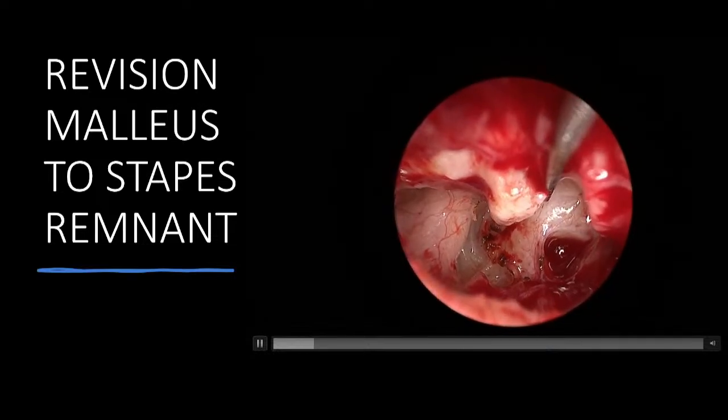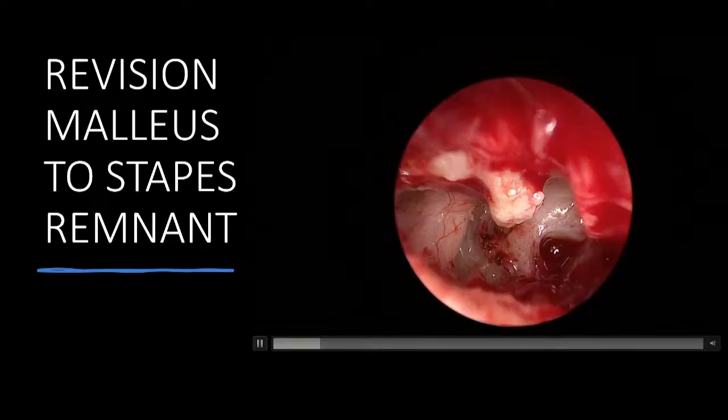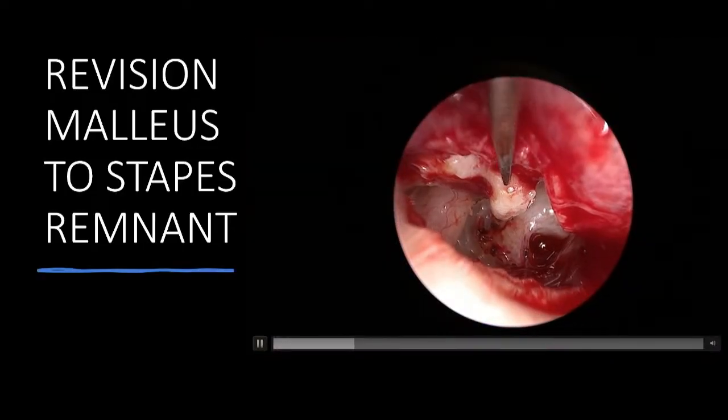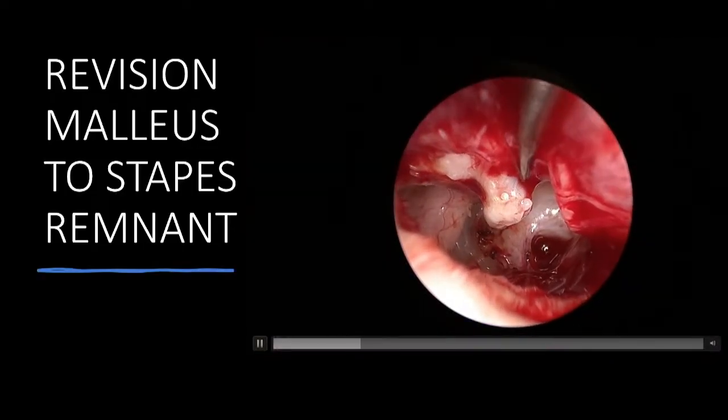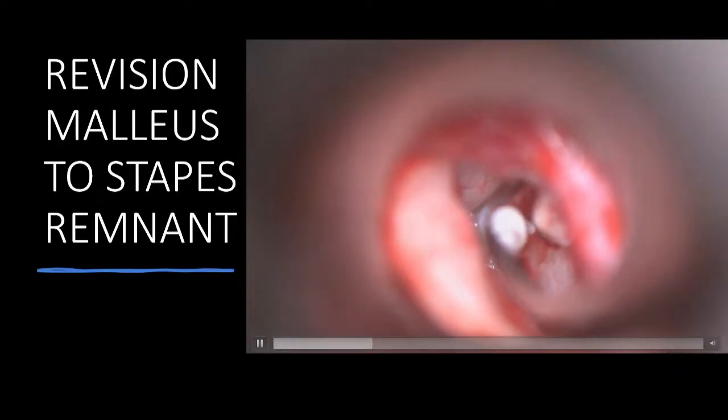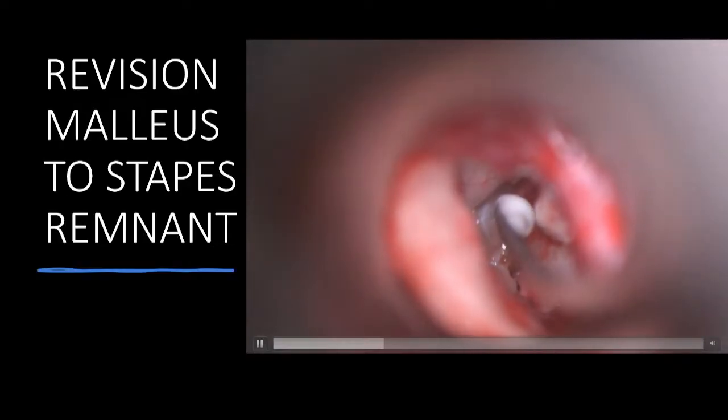and you can see here is a revision of one of my cases. What happened is I never really attached it well enough to the stapes. So what you're seeing there is actually Ketac-Cem that was attached, but it came loose because we hadn't really attached it nicely. So that's a piece of nylon. That's the Ketac-Cem, and so we gently put it on top of that nubbin.